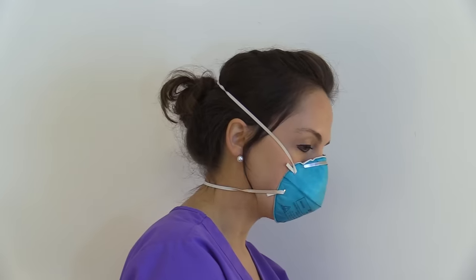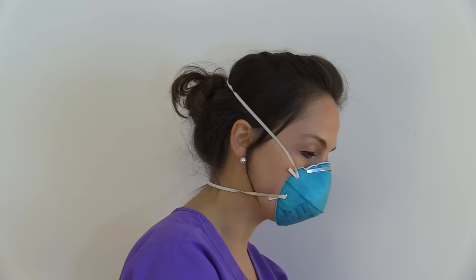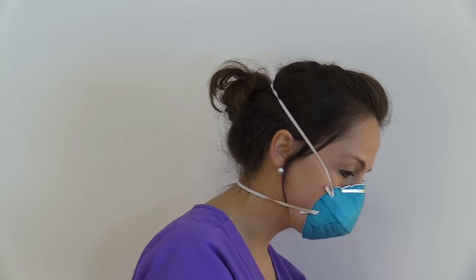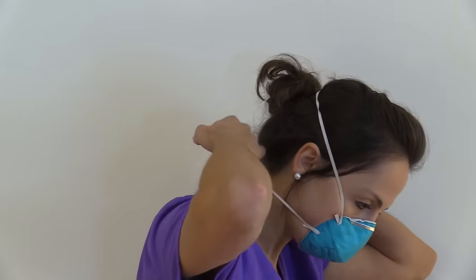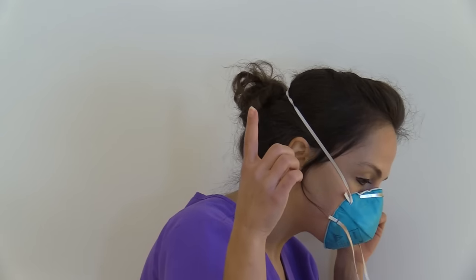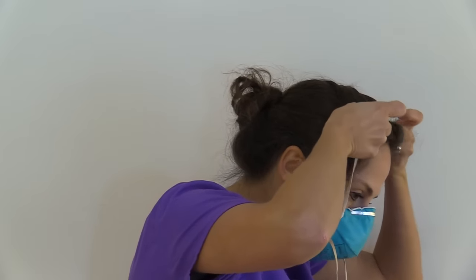Now we are going to remove our respirator. Remember, you will do this outside the patient's room with the door closed. We don't want to touch the outside of the mask, so we're going to slightly lean forward and remove the bottom strap first with both fingers — grab the strap and pull it over your head. Do not touch the front of the mask. Then remove the top strap in the same fashion and discard. Then you will perform hand hygiene.